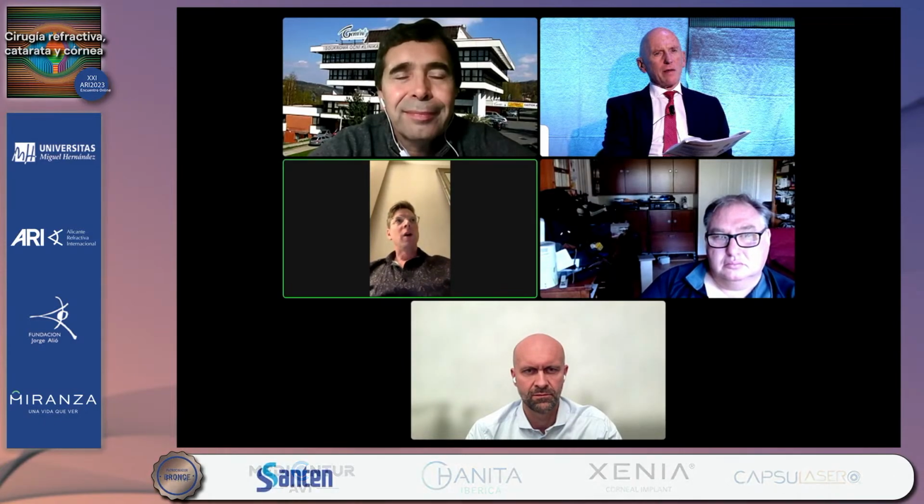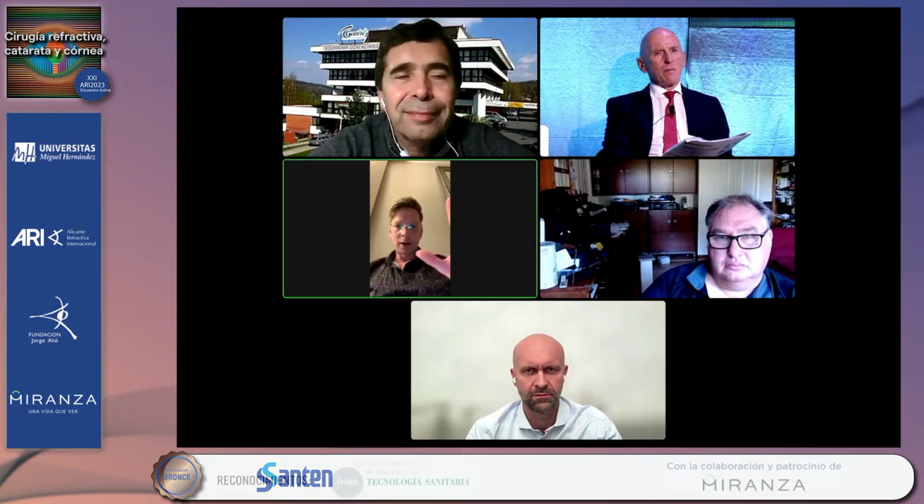Okay, 5.2. Tim, which is the diameter that you use more frequently? In regular cases, I go to 5.1. I have the feeling that we end up in this case because it's enlarged a little bit, maybe at 5.2, and that's fine for the premium IOLs. And the good thing in the complicated cases, pseudoexfoliation, is that I just adjust it to what's possible, just to get the cases done. Sometimes you have a small pupil, and as I showed, I will always adjust it to the part where I have a good staining to get a good capsulotomy on the fly.